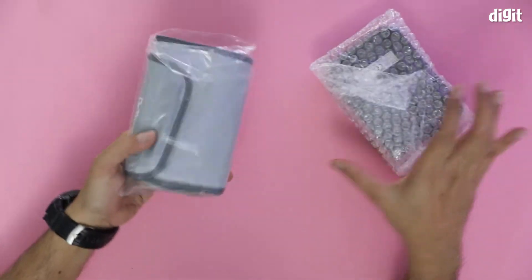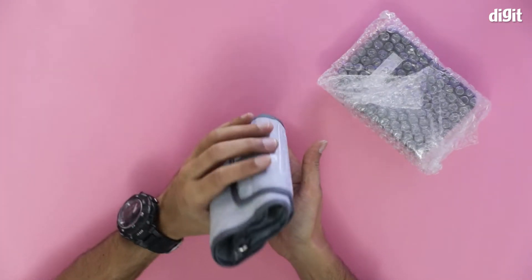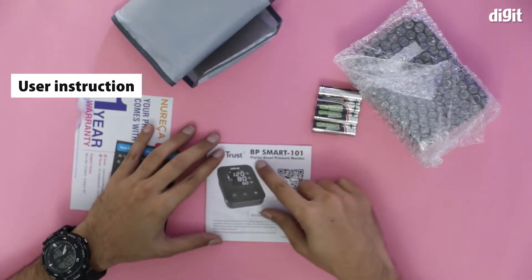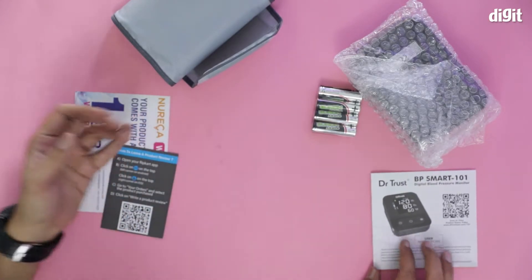There we are, this is it. These are the cuffs. I'm going to check them out first before I go to the monitor. There are a couple of documents. This is the Dr. Smart Digital Blood Pressure Monitor user instruction. You must read this — it is a medical device, so you must read this at least once.